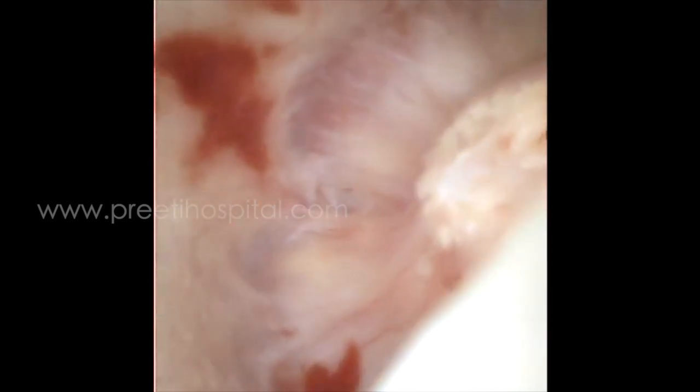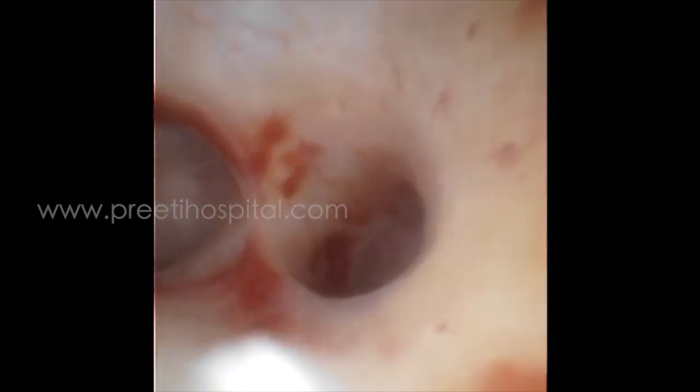We all use disposable scopes many times, but this is a digital non-disposable scope. This is the first time I am seeing a detachable digital scope.